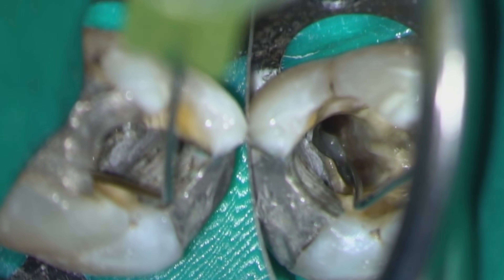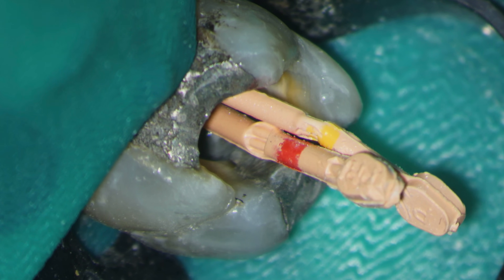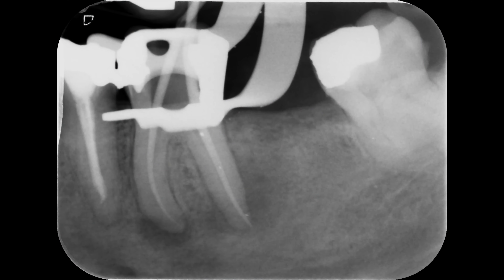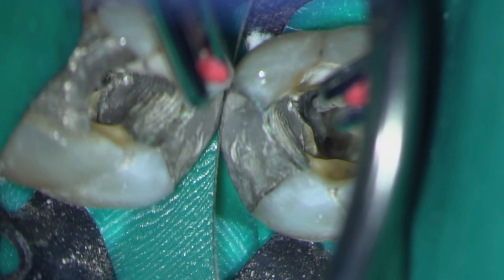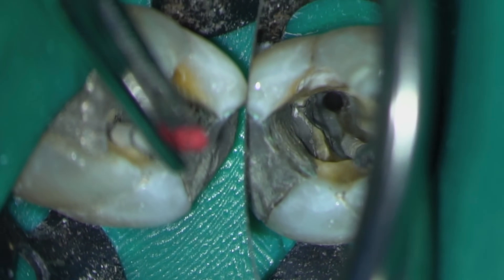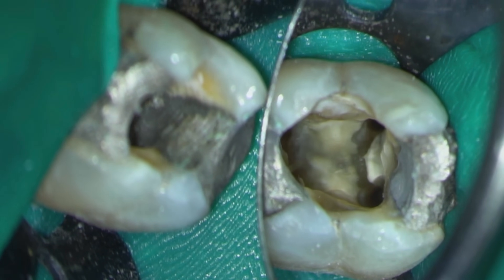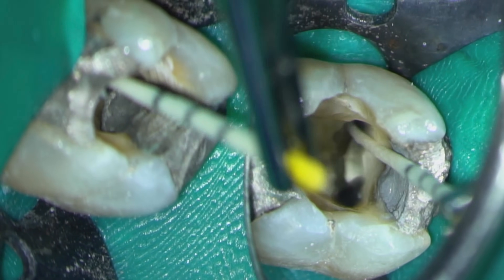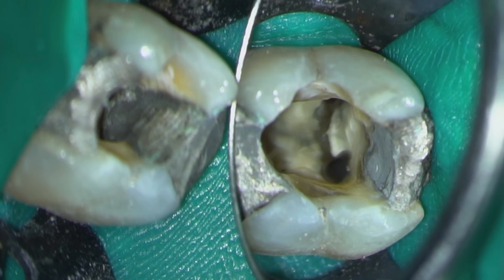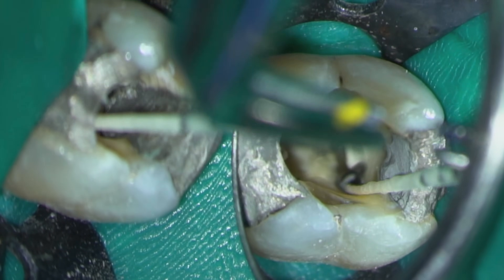Next, a cone fit radiograph — I like to do this with irrigant in the root canals as this prevents the tips of the GP binding. You can see that I've got good working length now in the distal root, where it was slightly long in the diagnostic radiograph. After irrigation with the sequence of 3% sodium hypochlorite, 17% EDTA, and then hypochlorite again, I can now dry the canals using sterile paper points. The irrigation protocol is key: sodium hypochlorite, EDTA or citric acid, followed by sodium hypochlorite. You should never use chlorhexidine if you're going to use a BC sealer.